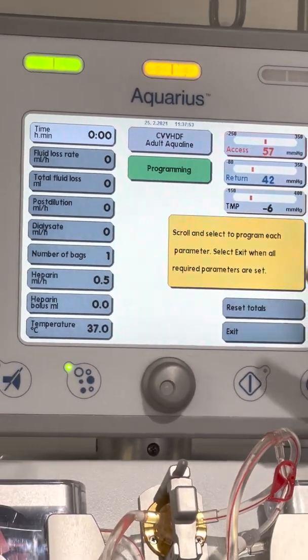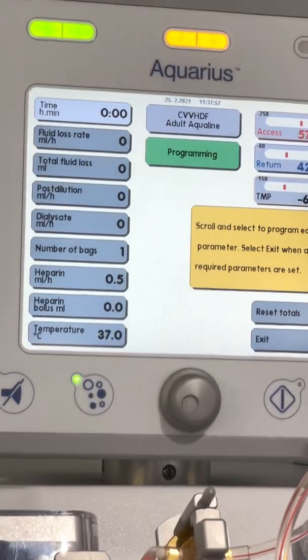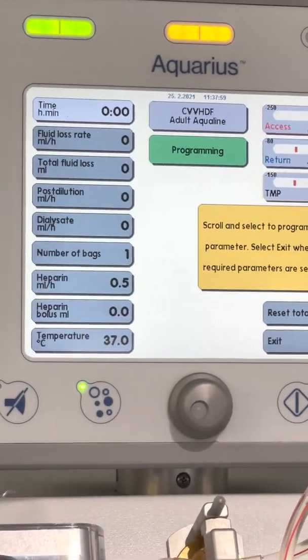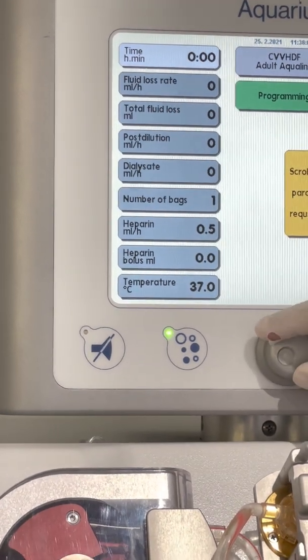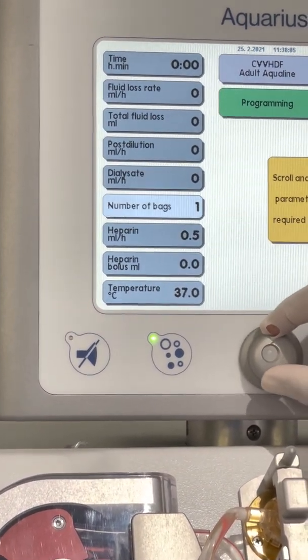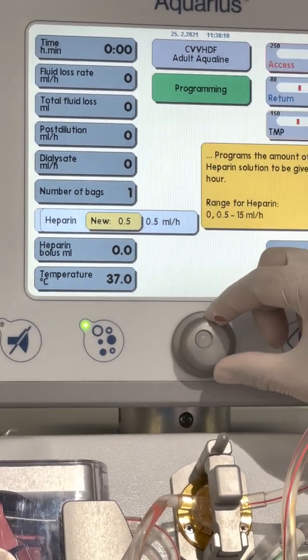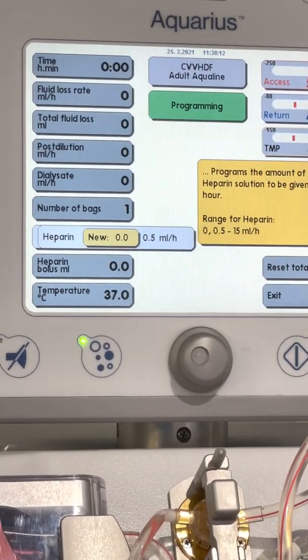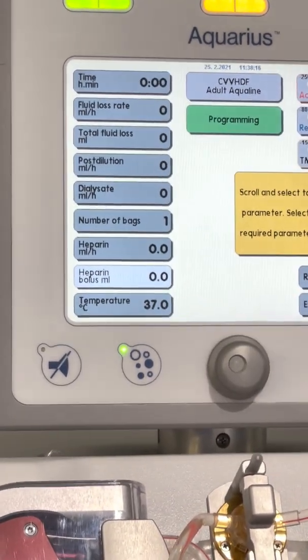So how many hours, fluid rate, total, same like this. And number of bags, of course we put 4, so we will put it 4. This is the heparin, this is what I'm saying. You can turn it off here. Now it's 0.5, that's the default. So make it 0 if there is no heparin. If the doctor adjusted the order, then that's the time you have to put the figures here.